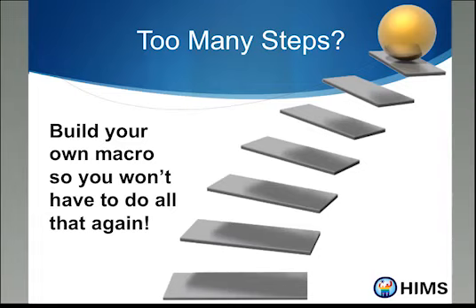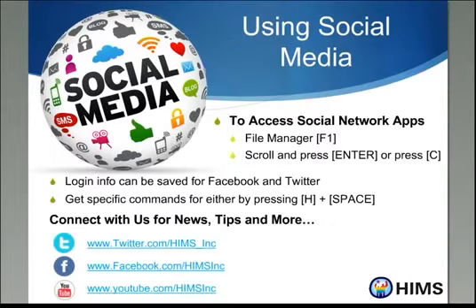Just a few more things that we want to show you on here. We have all kinds of social media stuff on here. We have an app for Twitter. We have an app for Facebook. We've got Google Chat. We've got Google Talk. We've got YouTube on here.